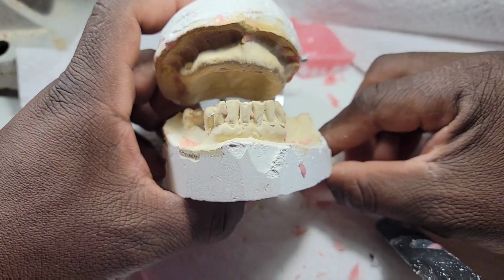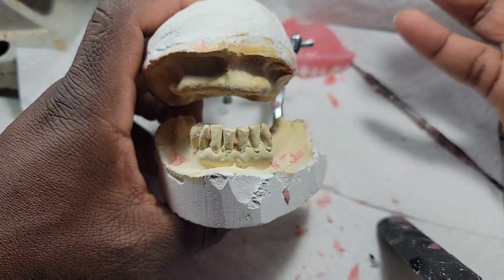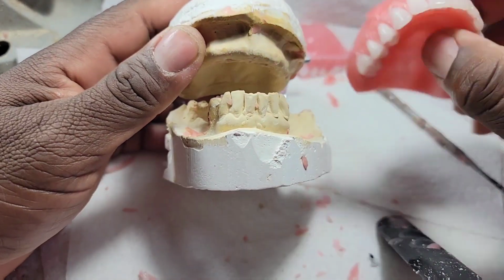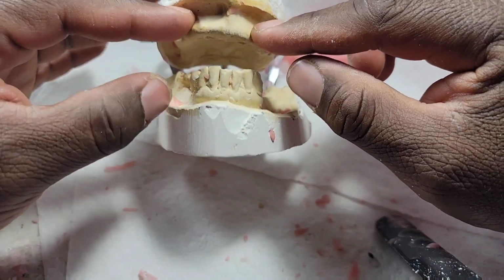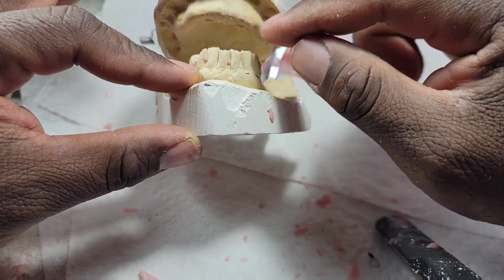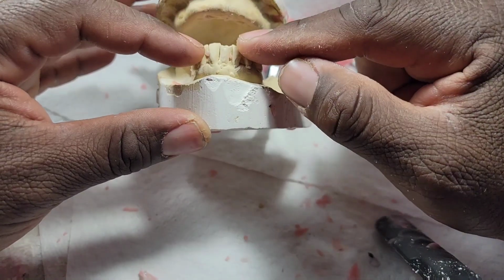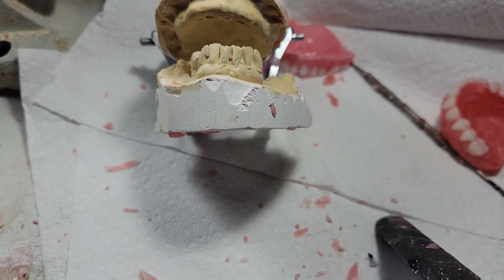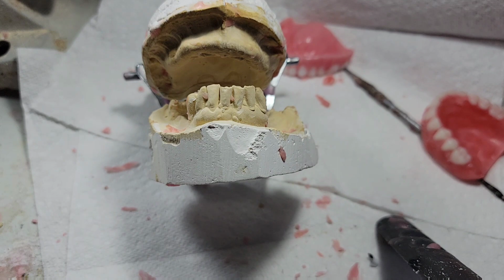What happens when a bite is extremely open? When a bite is open, it creates weight on the denture, and the weight gets too heavy. For me to reach this distance between here, obviously I had to set the teeth around those natural teeth. In order to reach here, I had to build it up with wax, because the teeth are not gonna reach there.